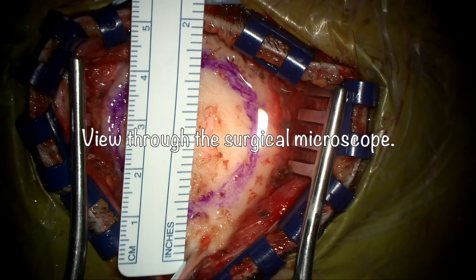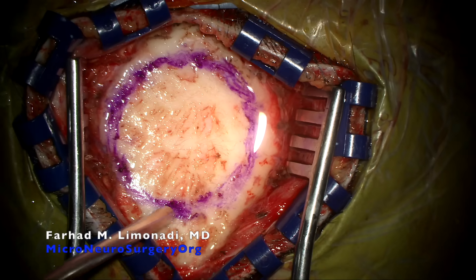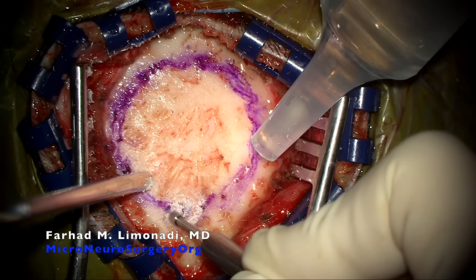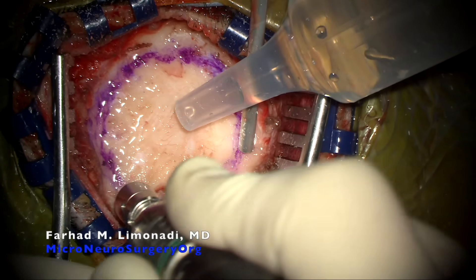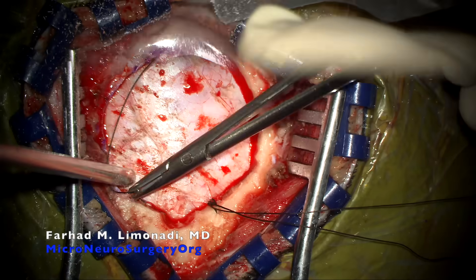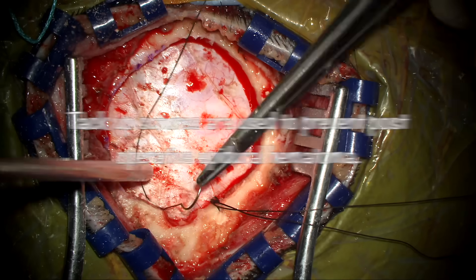Here is a view through the surgical microscope. The surgical corridor was optimized for a dissection plane parallel to the primary motor and sensory cortex, minimizing shear forces on these delicate tracts during dissection. Primary sensory cortex is in the anterior and superior portion of the surgical exposure. A circular bone flap was then elevated using a single burr hole exposing the underlying relaxed dura, induced chemically using hypertonic saline and mannitol.